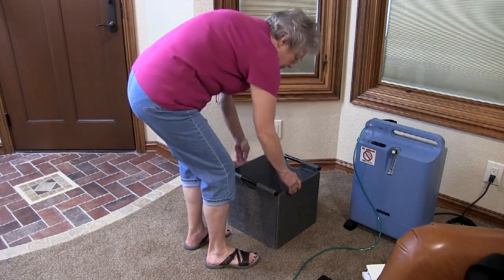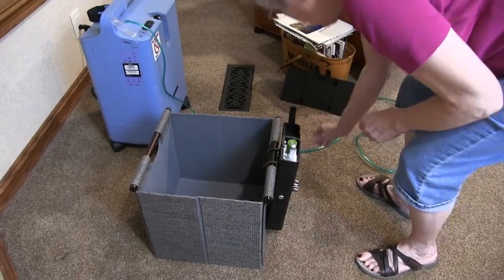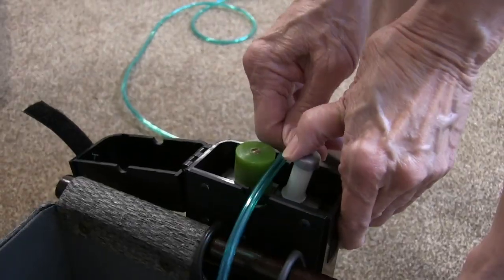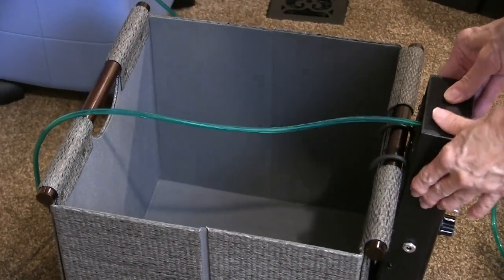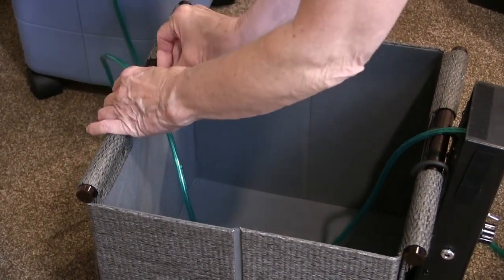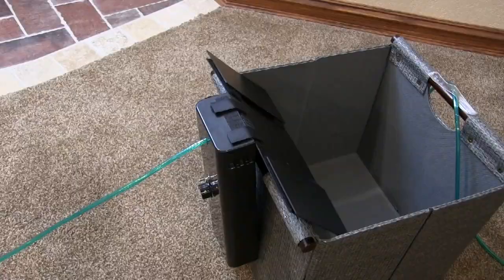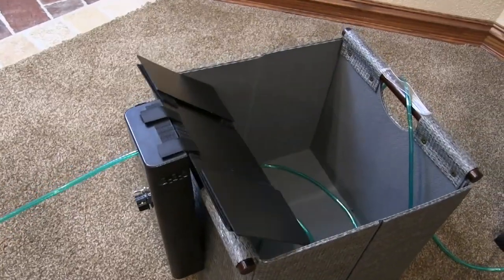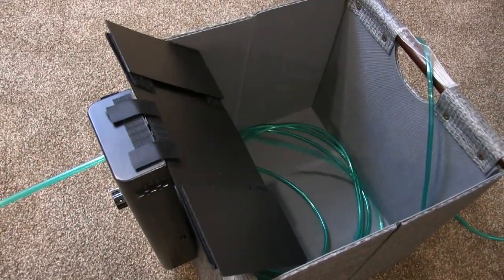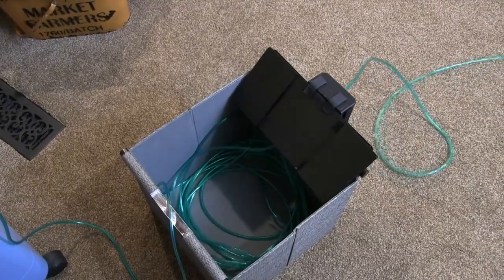Extremely simple to use — just select a small container of your choice on which to hang the OTCR, and in seconds you'll be controlling your tubing with the push of a button. The OTCR will collect tubing as you walk towards your concentrator, and release it as you travel away.